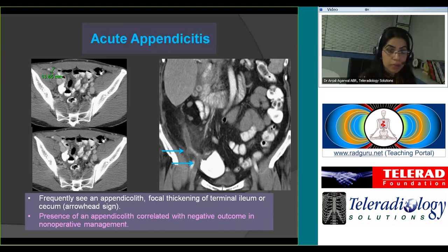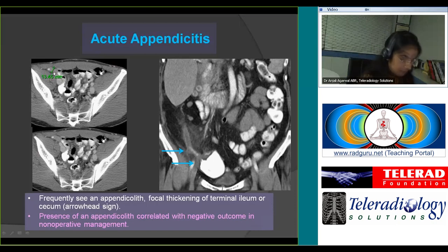Here is an appendicolith seen in a case of inflamed appendix, with dirty fat indicating inflammation. Another case of appendicitis with an appendicolith — the appendix is thickened, measuring 13 millimeters.